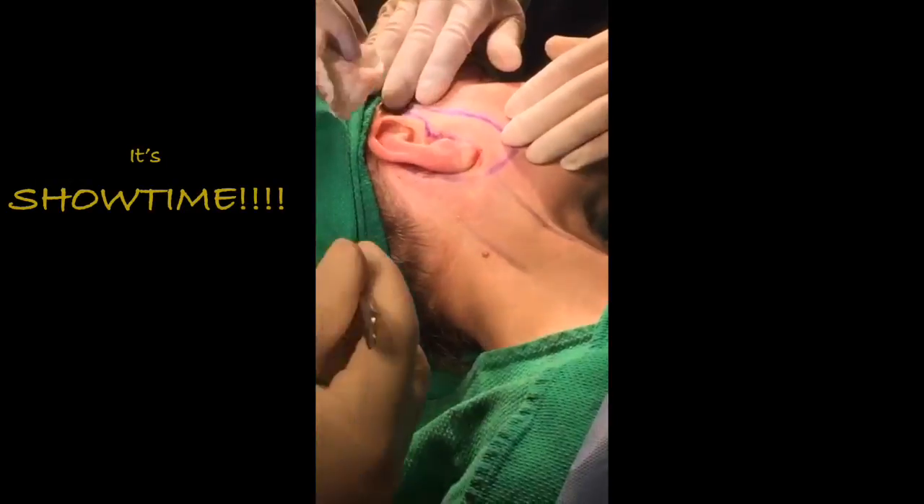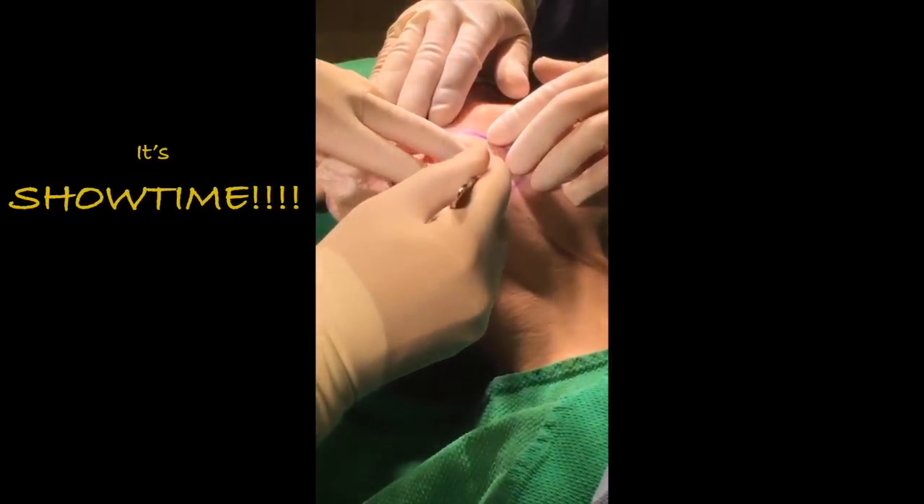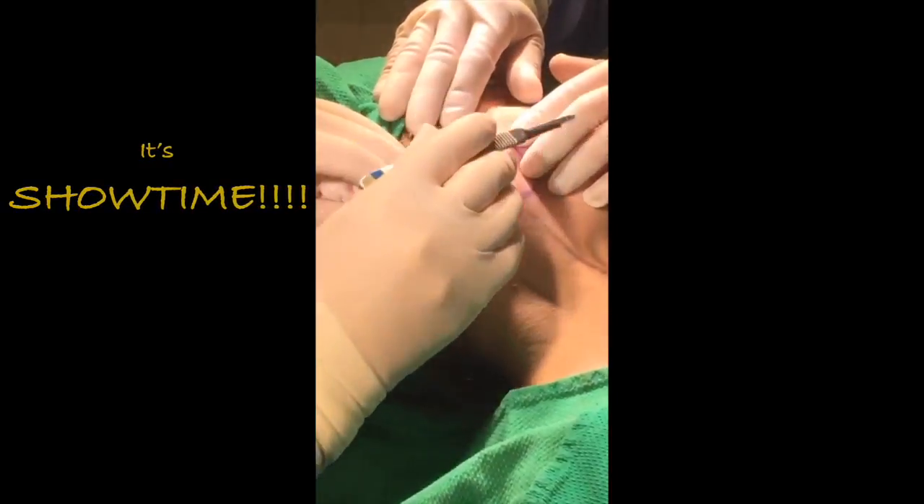We've finished all the freezing. She's completely frozen. I'm going to make an incision along the contour of the ear, maybe a little bit behind the ear, and I'm going to undermine the skin.